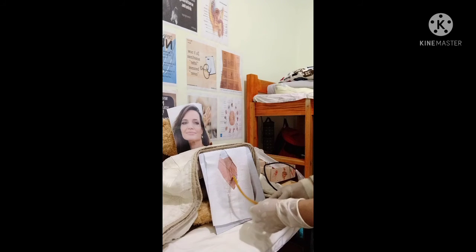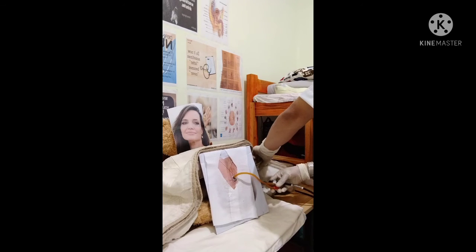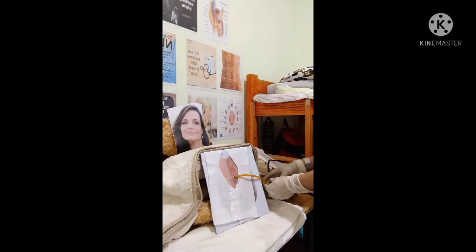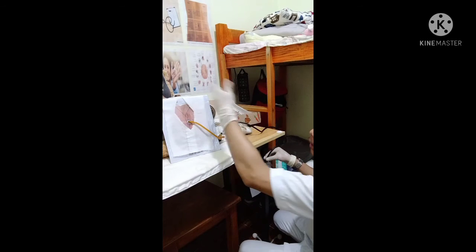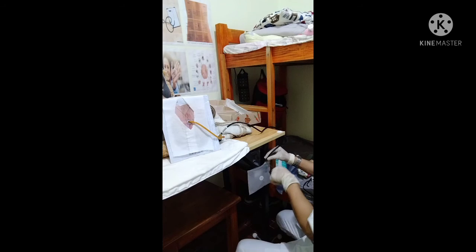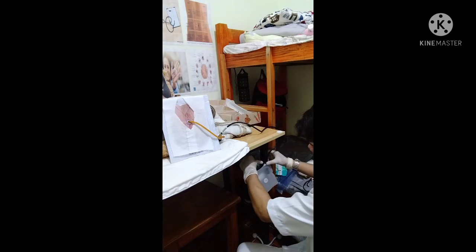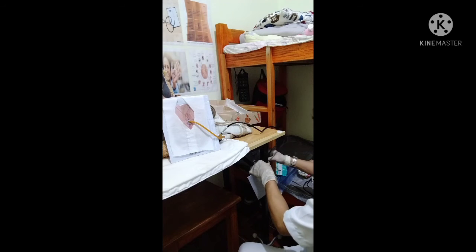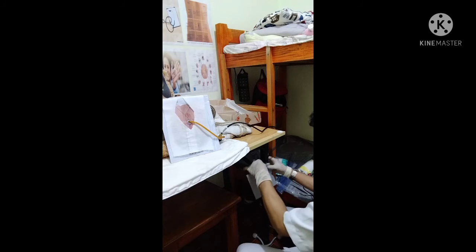Okay. So ma'am, dikit ko siya sa thigh po. So I've already taped it to our patient's thigh. So I will just put the urinary bag here, so that it will allow, of course, comfort to our patient. Like that.